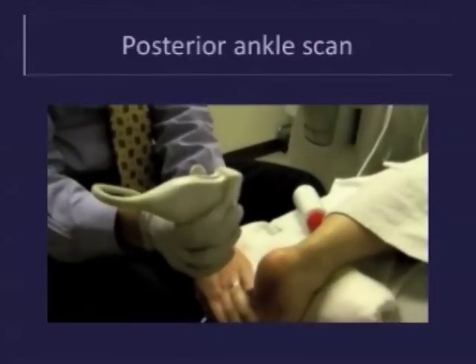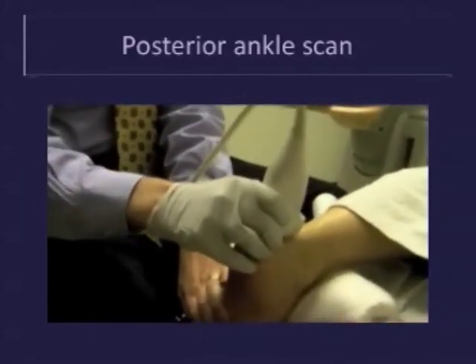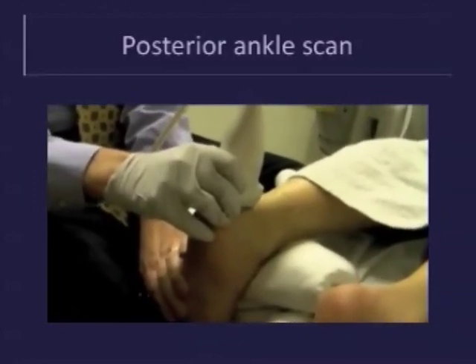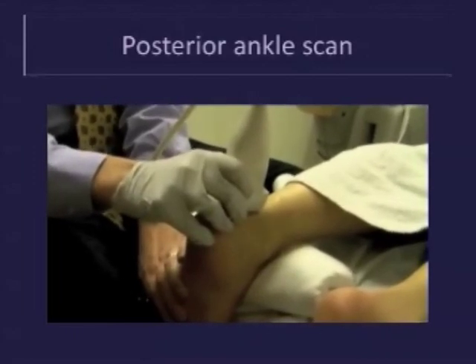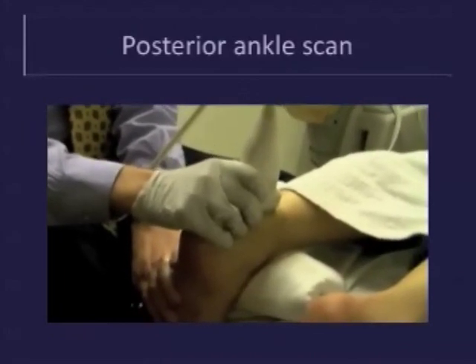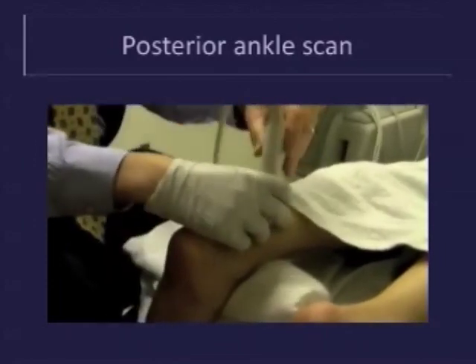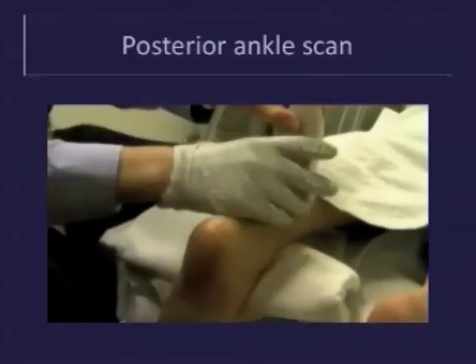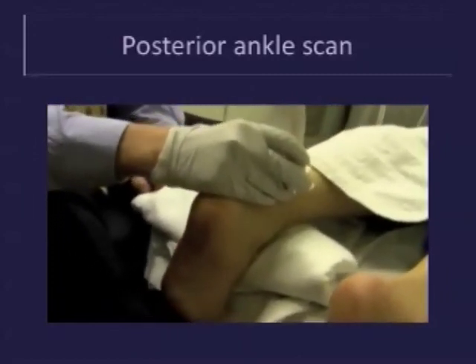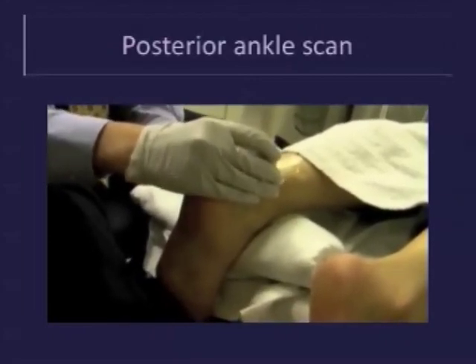In the slide video demonstration, the posterior ankle is scanned with the patient prone, their foot hanging off the end of the stretcher. Place the probe over the calcaneus and image the distal Achilles tendon in the longitudinal plane. Slide the probe superiorly along the tendon up to the musculotendinous junction. Then turn the probe transverse and scan the Achilles tendon in the axial plane while sliding down towards its insertion. Scan until the Achilles attachment site to the calcaneus is identified.